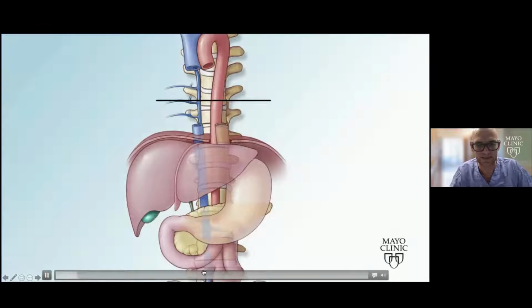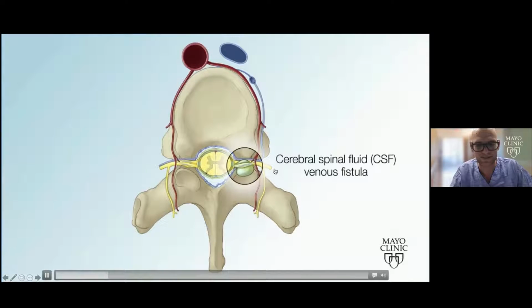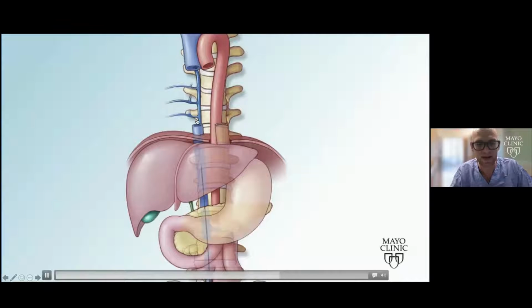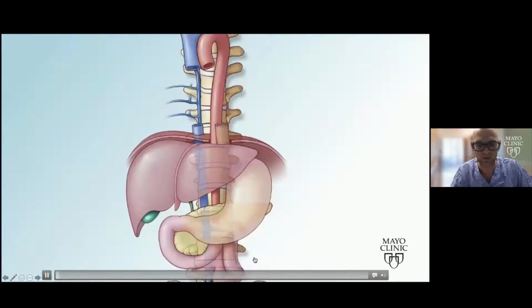So the idea for that first patient, a right thoracic fistula, would be to try to find a way to advance a catheter up the IVC, into the SVC, then into the azygous vein, and then advance a little microcatheter into this paraspinal vein, and then shut down this whole vascular complex with glue or Onyx.